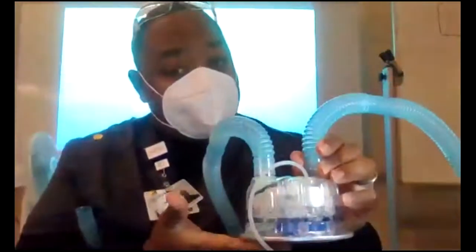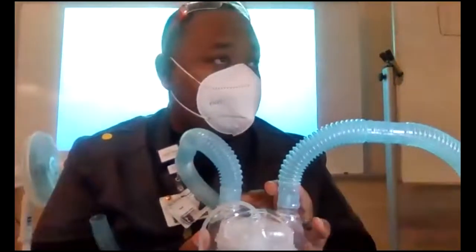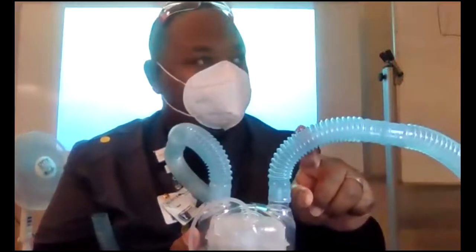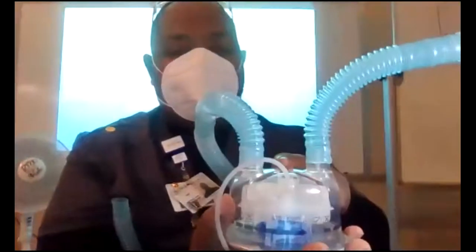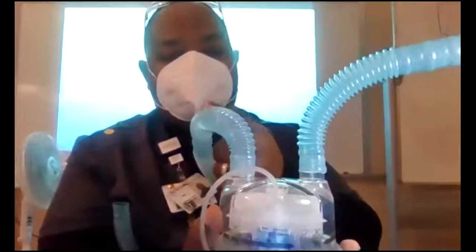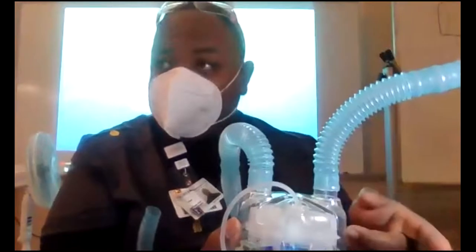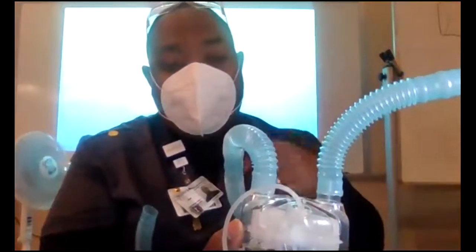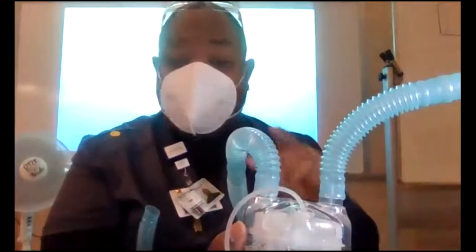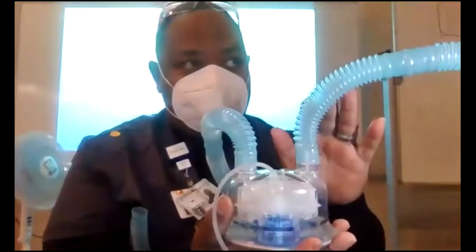This is a Passover without the heat, but if it was with heat, it would be generating more moisture, right? And so as the gas travels from the machine into the humidifier, it will pick up that moisture from the water and then come up this way back to my patient. That's how they get their humidity and their heat. Especially if they have a bypassed airway, you want to provide humidity and heat to that airway. And so this will be a way that you do it. Don't forget the difference between passover and cascade.